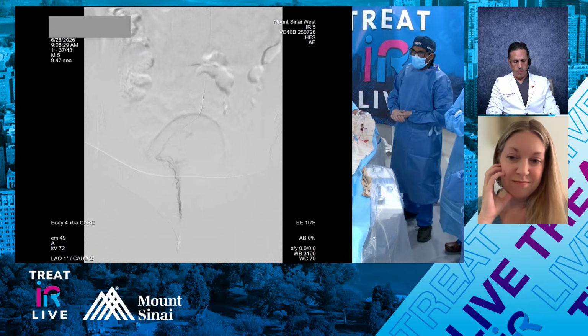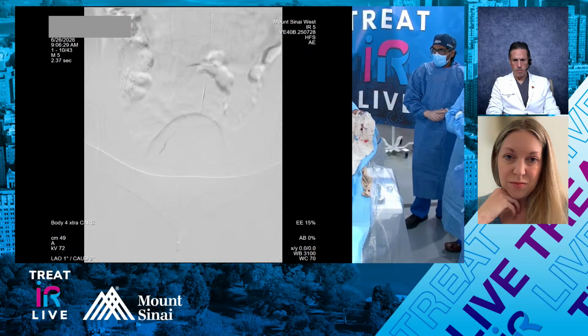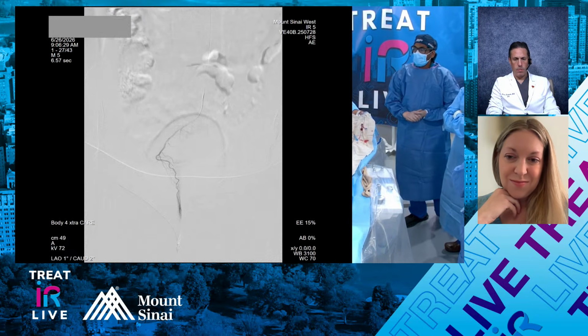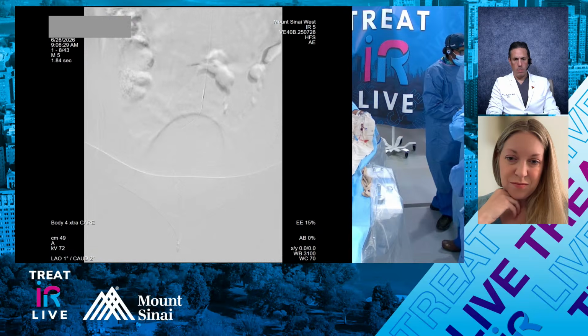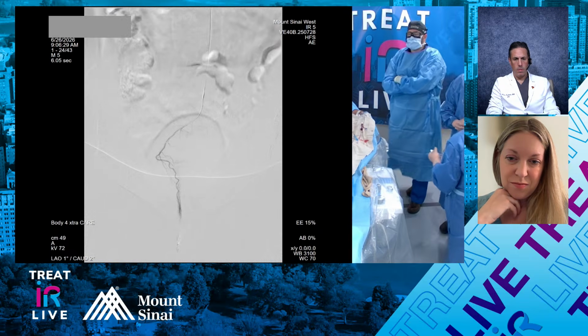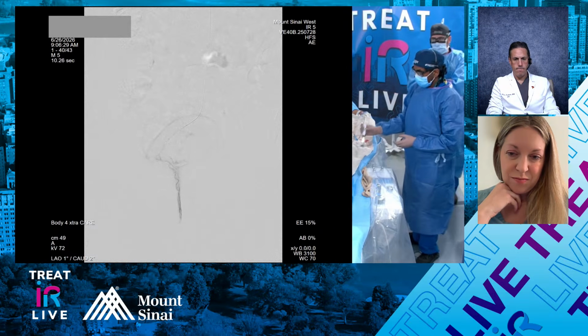So for that reason, I know there are mixed opinions on whether to do particles or just coils alone. For me, I like to do some particles, just conceptually, to try to get into the distal communications with possible middle rectal and inferior rectals.